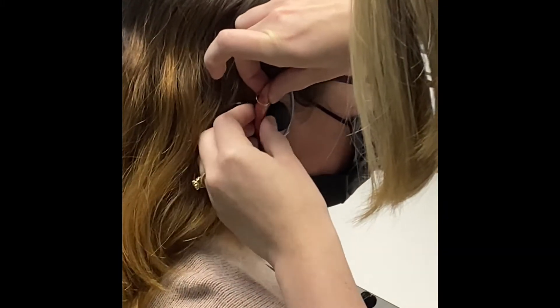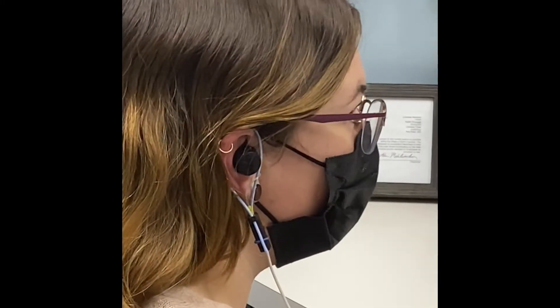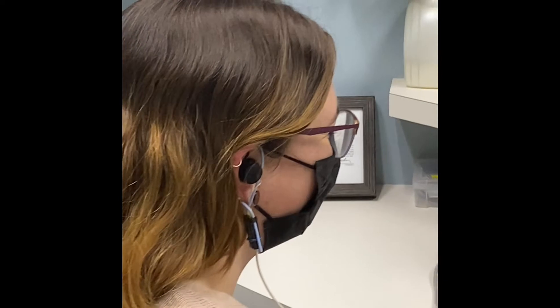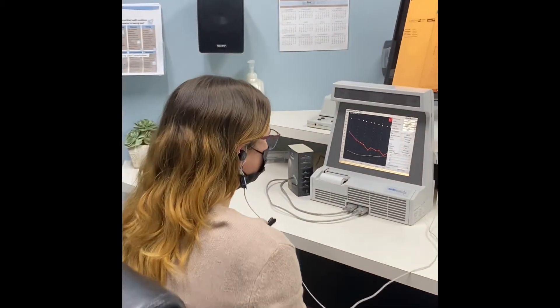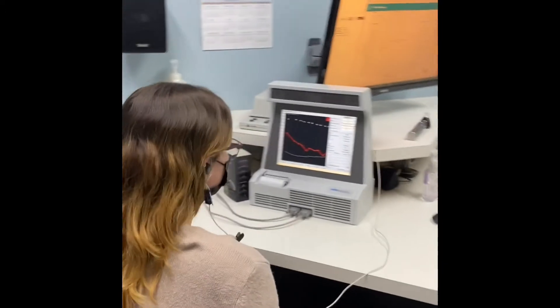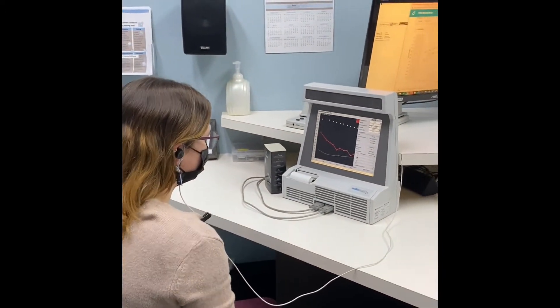You have little ears. Is that how it was fitting when you were wearing it around? And it honestly said that they were too small. So what we're going to do now is have her hear a passage about carrots, the vegetable, and we're going to see exactly what those hearing aids are doing.